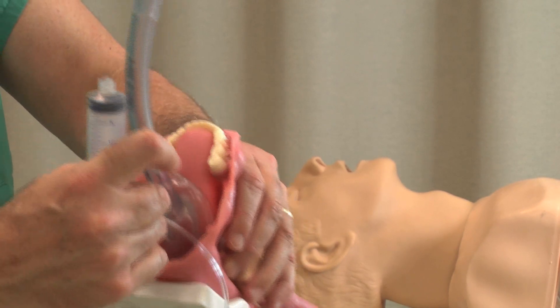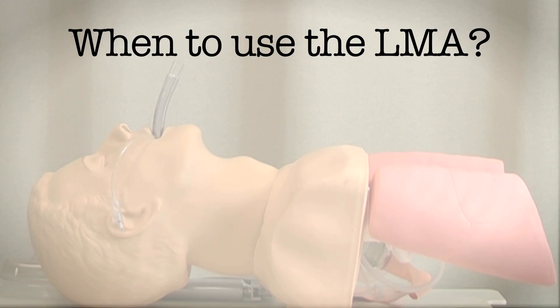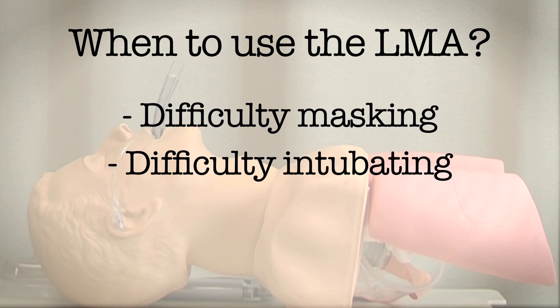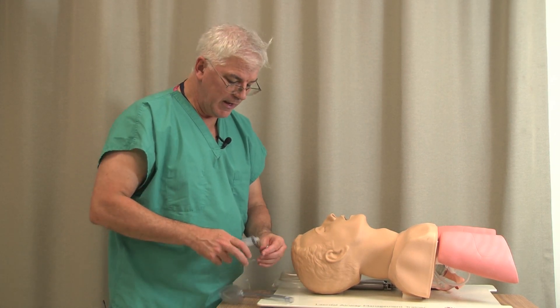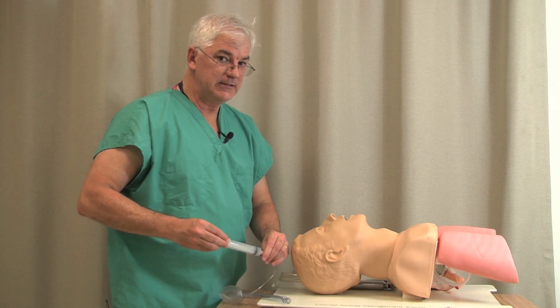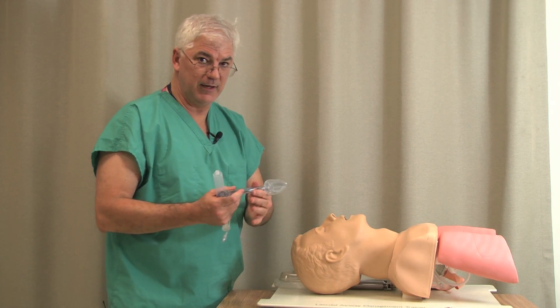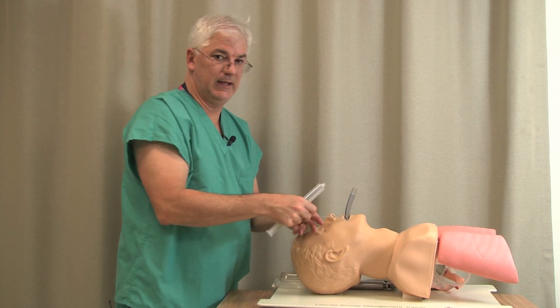You're basically mask-ventilating but just farther down. When would you use the LMA? Again, in the ICU, you're really only going to use it as a temporizing measure — you're having a hard time masking, you had a hard time intubating, the patient is desaturating and things are not going your way. Then you say, since intubation is not working, I need to mask but I need to mask better. That's where the LMA comes in handy.